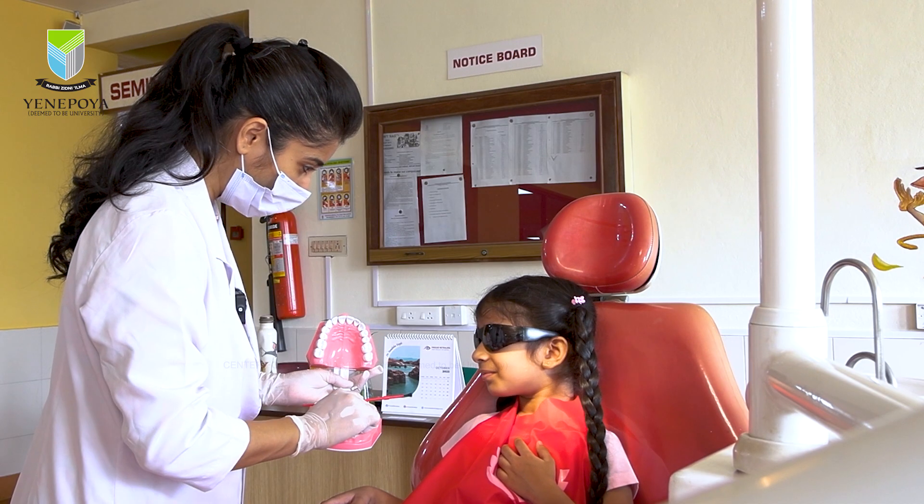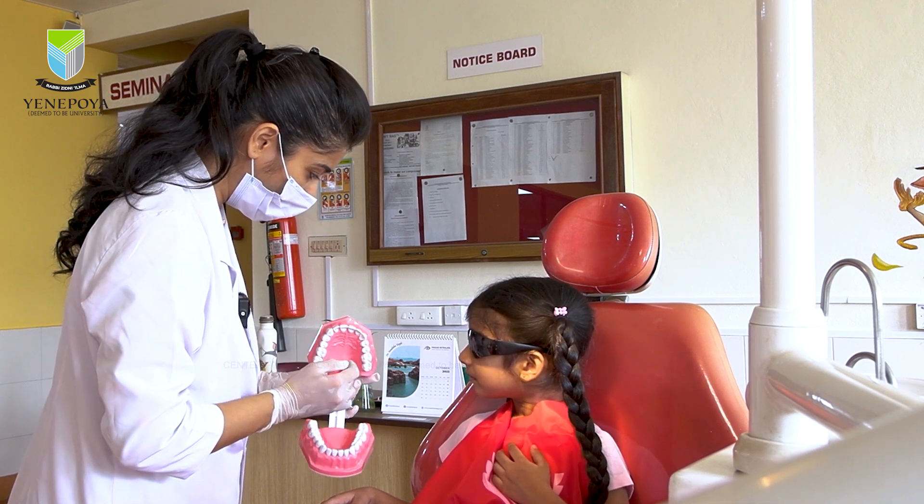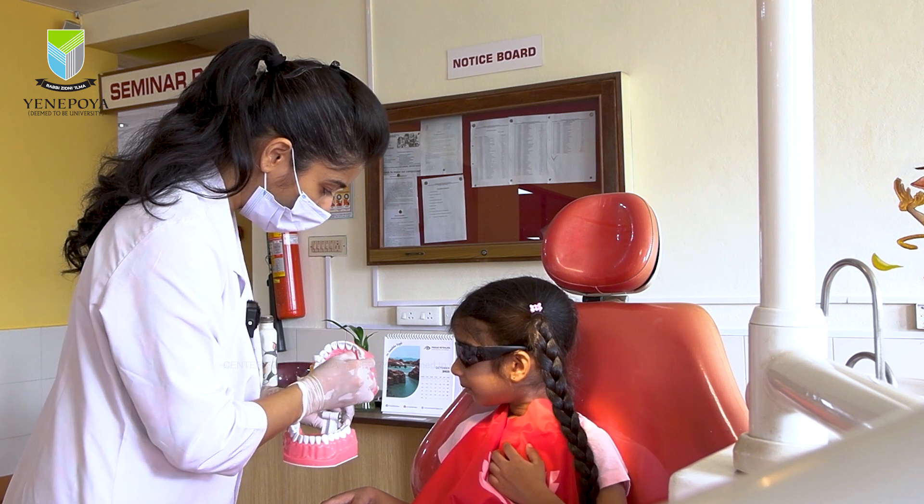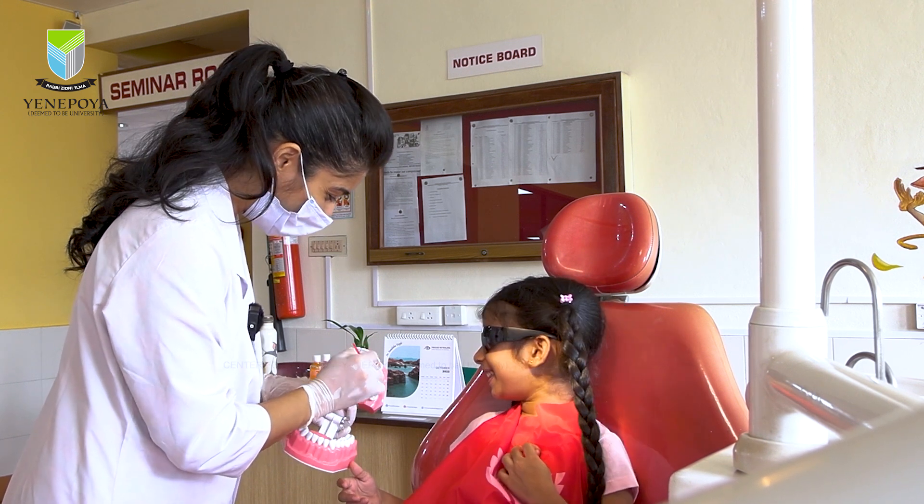A well-informed patient always cooperates better during the procedure. Hence you could use tell-show-do by demonstrating the same on a model prior to the application.